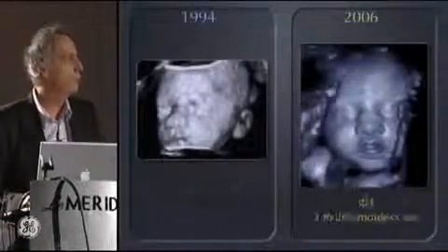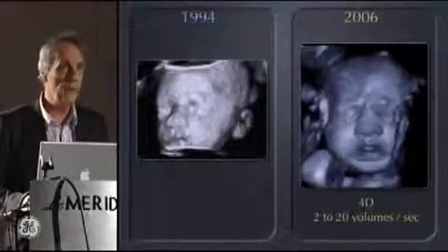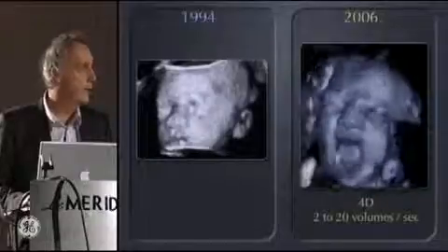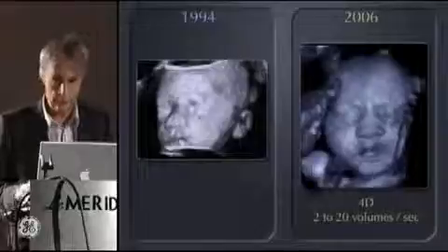And also what we can do now is to use 4D. 4D, it's a real-time 3D, and you can go from 2 volumes per second to more than 20 volumes per second.